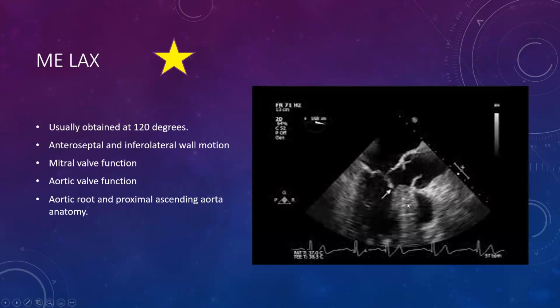One of the things that I liked about this picture is that you can see, obviously, aortic valve is open, right? So we're in systole, but this doesn't look like it's going to be very helpful for your cardiac output. So this is someone who's experiencing SAMing, so systolic anterior motion of the mitral valve. So you can see this and know, okay, I want to give volume, I want to bring down the heart rate, and I want to increase my afterload. So volume and phenylephrine would be a great choice for this patient if you see this.